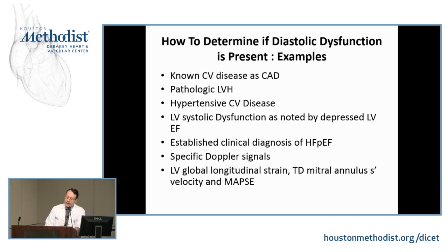Systolic dysfunction clearly manifested by a depressed EF, and we are not talking about those athletes who are engaged in aerobic activity and you're looking at lower limits EF. We're talking about a diseased heart, say with an EF of 40% or so. A HFpEF diagnosis, if established.